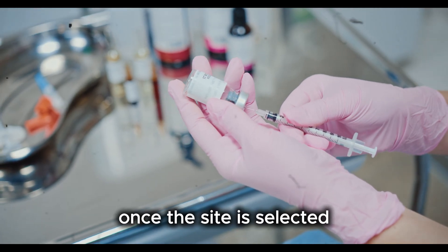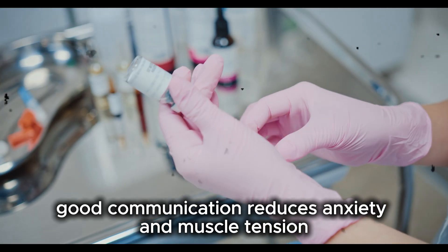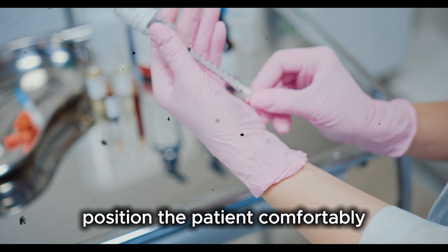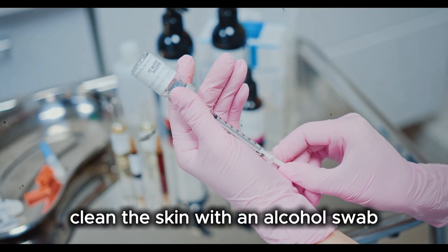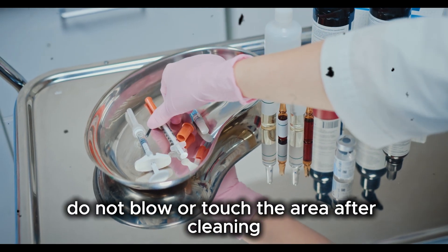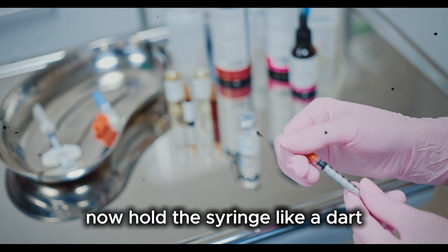Once the site is selected, explain the procedure to the patient. Good communication reduces anxiety and muscle tension. Ask the patient to relax the muscle and position them comfortably depending on the injection site. Clean the skin with an alcohol swab using a circular motion from center outward. Allow the skin to air dry. Do not blow or touch the area after cleaning. Now hold the syringe like a dart.